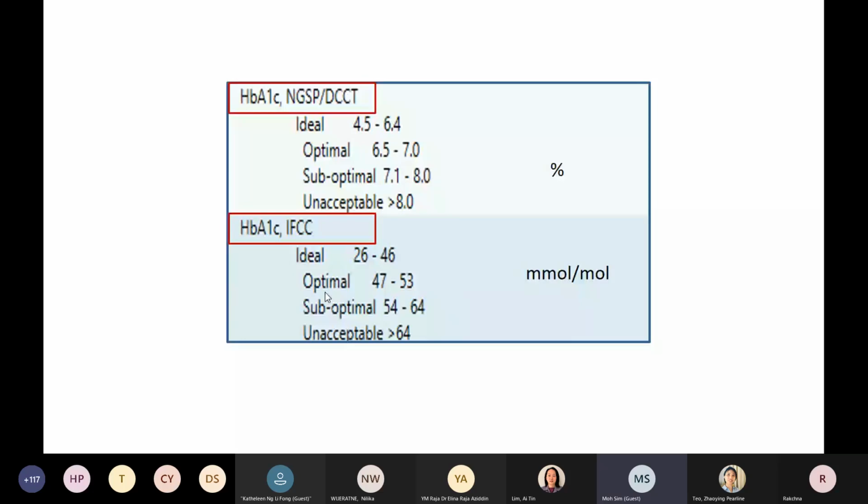The methods we use to measure HbA1c at point of care in the laboratory in my hospital, and fundamentally we never report any value greater than 14%. And this is where we actually have to explain, as we teach our patients, that it's not a 0 to 100 scale. The minute your HbA1c is 8%, it means that your glycemic control is really very poor and needs to be optimized. So let's move on to patient 5.